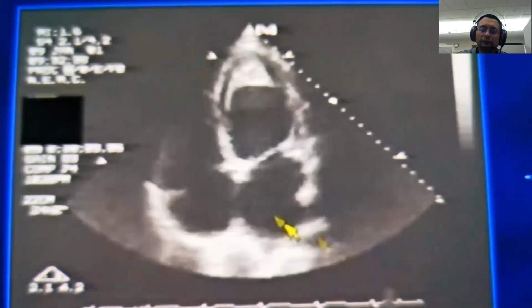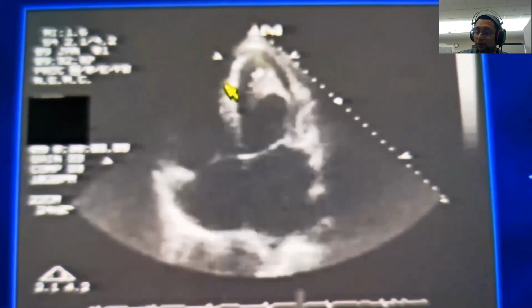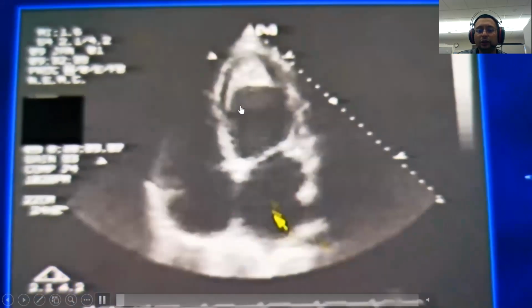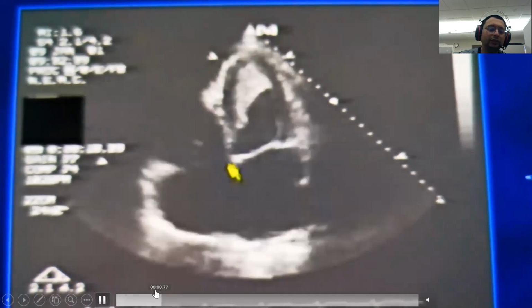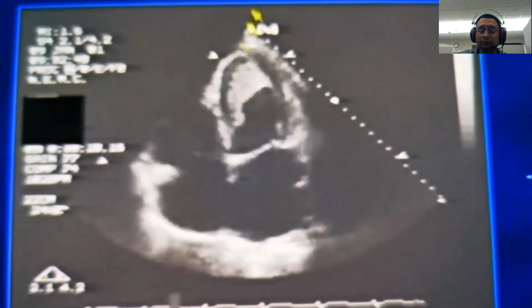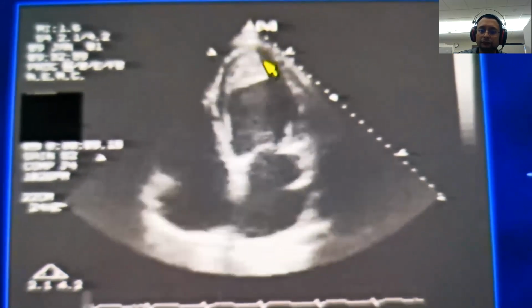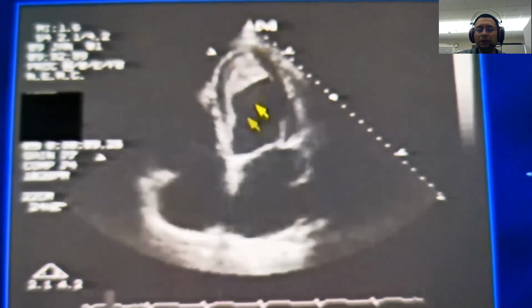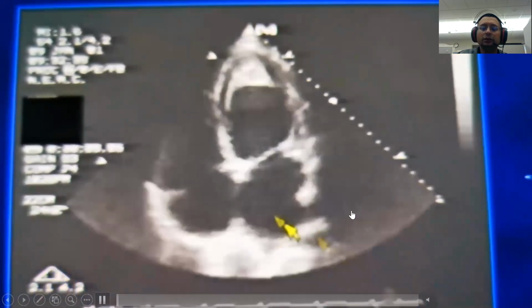This is intramyocardial hematoma. So one of the differentiations is intramyocardial dissecting hematoma. But with intramyocardial dissecting hematoma, usually you will see a layer of endocardium there. Yeah. So let's say that this is not intramyocardial dissecting hematoma. So what are the differential diagnoses other than that? A clot? Yes. So this is apical clot. Okay. Apart from apical clot, what about the color, Sarah?